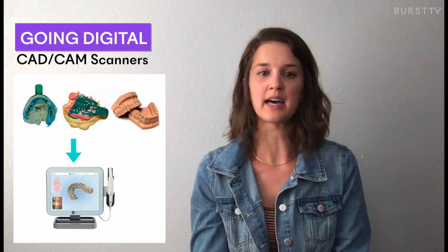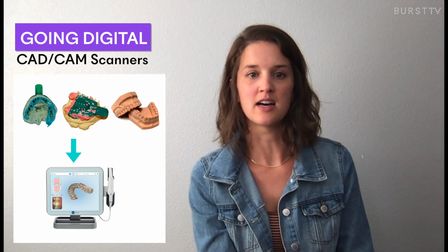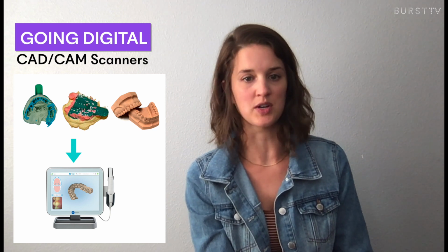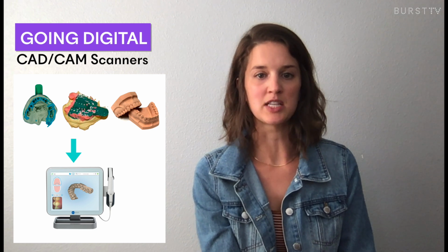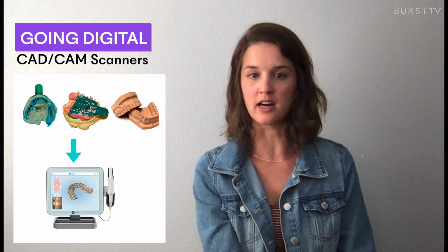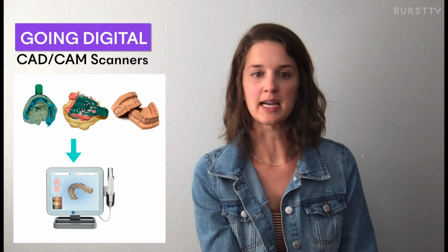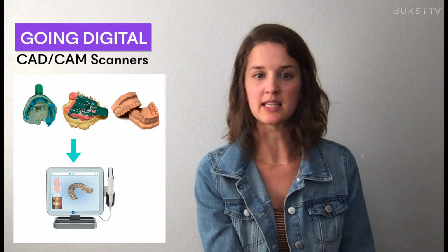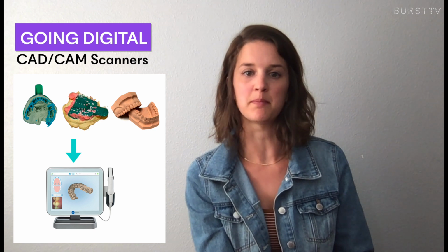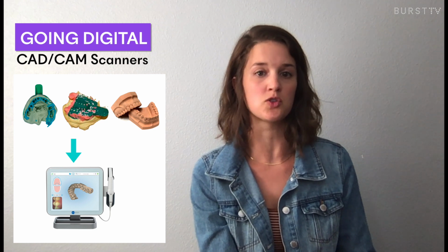As a slightly newer product to this list of digital, we have digital scanners. The long-term cost savings on the impression materials, stone, and trays, as well as potential for discounted lab fees or even no lab fees if you're doing it in office with crown milling or other devices. There's also the time savings included by eliminating the need for retakes and the time spent prepping, pouring, allowing adequate drying time, and then trimming the models.